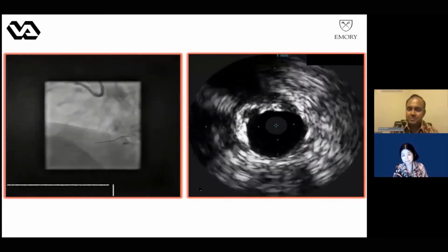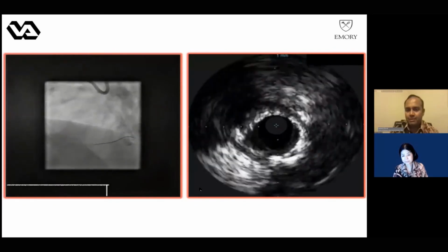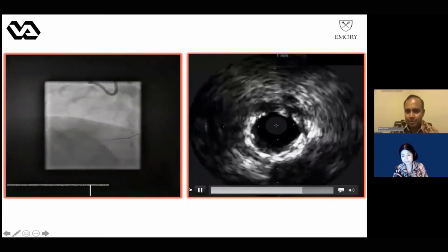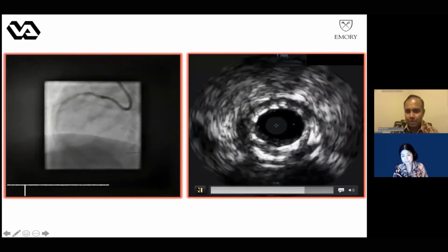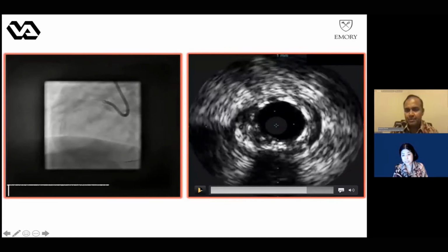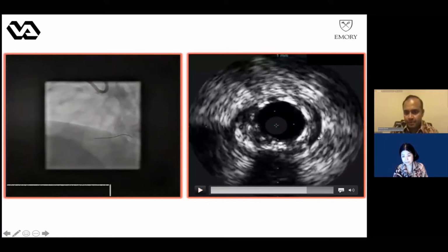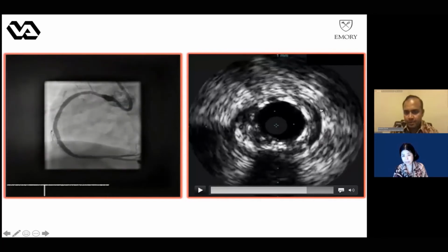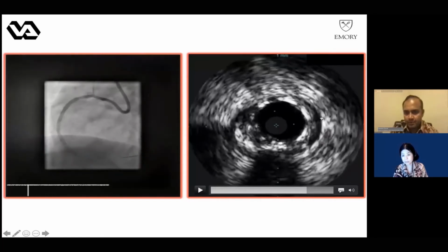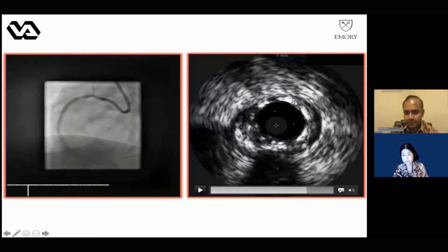Yeah. And as we get more proximal, now this is the proximal edge of the stent, and I will pause it for you here, Akiko, so you can tell us what you're seeing there. Yep. So starting here, there is a very funny finding. Currently at 3 o'clock, there is a dark area, which is outside of the intima, right?